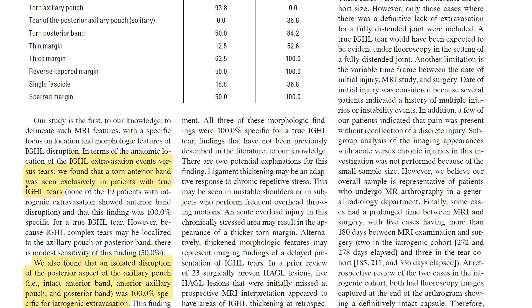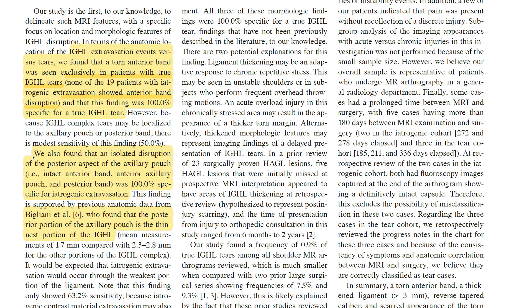If the anterior band is torn, you are really dealing with a true lesion. This is confirmed in the study: all 19 patients with iatrogenic extravasation had an intact anterior band — making this a very specific sign. Additionally, isolated disruption of only the posterior aspect of the axillary pouch, with intact anterior and posterior bands and the anterior axillary pouch, indicates iatrogenic extravasation. This is supported by Biliani's study showing the posterior portion of the axillary pouch is the thinnest part of the inferior glenohumeral ligament complex.